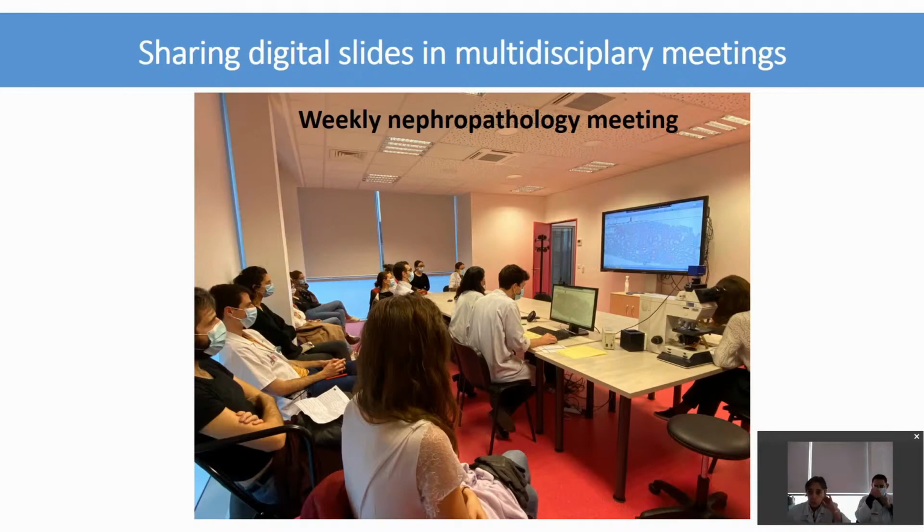The facility to share digital slides also allows us to improve clinicopathological discussion with physicians in multidisciplinary meetings. The picture shows the weekly nephropathology meeting that takes place every Friday morning in our department. Seven nephrologists are on site, but nephrologists from another Assistance Publique Hôpitaux de Paris hospital, Ambroise Paré Hospital, participate via a web conference and can look at the biopsies commented on by our pathologist here.